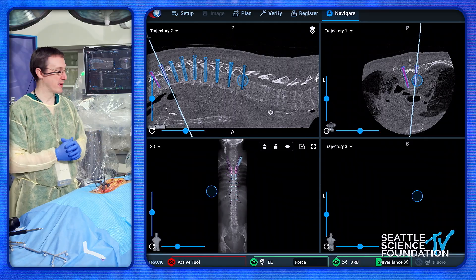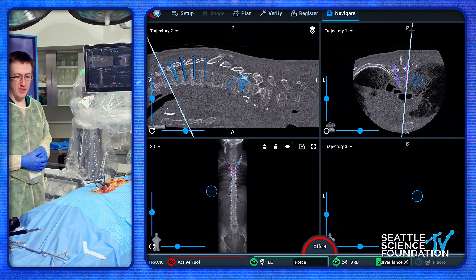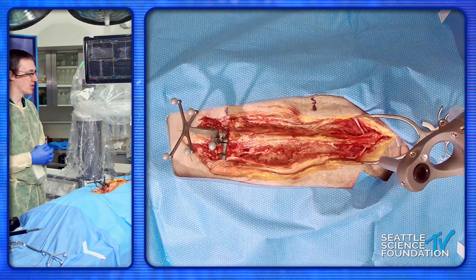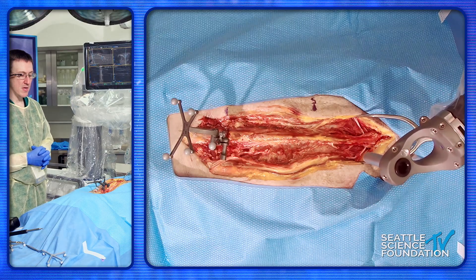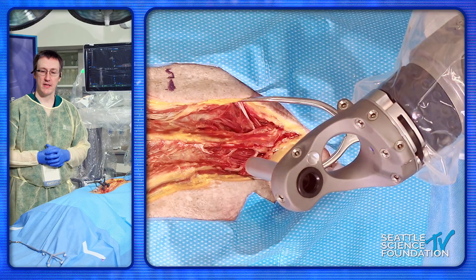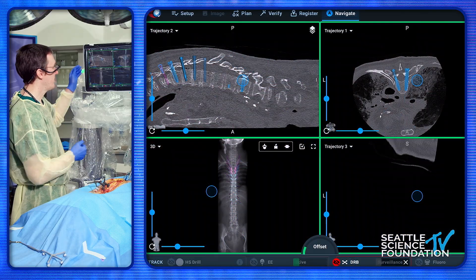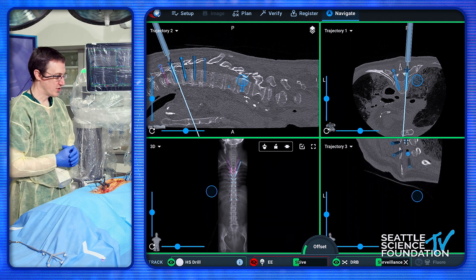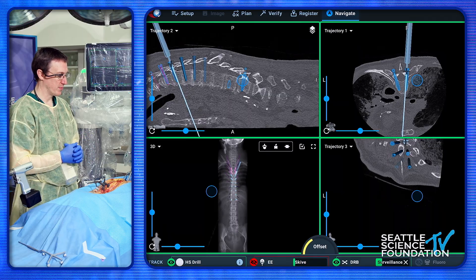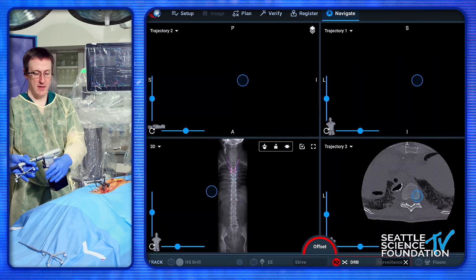Dr. Minasalli and I are going to take you through some of these pedicle screws — let's start with T5. We already did our anatomy check with our chicken foot, but we can show that for you as well, just to confirm that we are where we think we are. We'll start with the burr — this is just a light dusting to get that opening for the router bit to go down. We can see on the screen that we're headed in the right trajectory. You're just going to lightly touch and let it spin, opening up that little bit of cortex to give you a nice spot to place your drill.